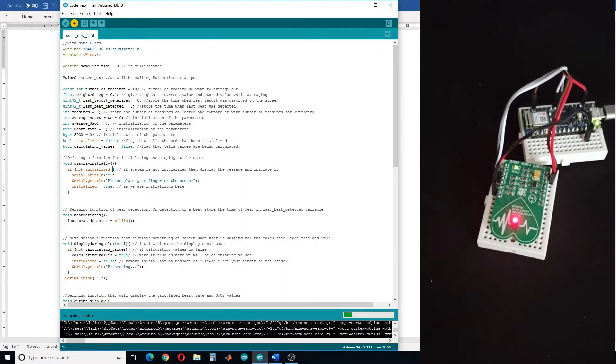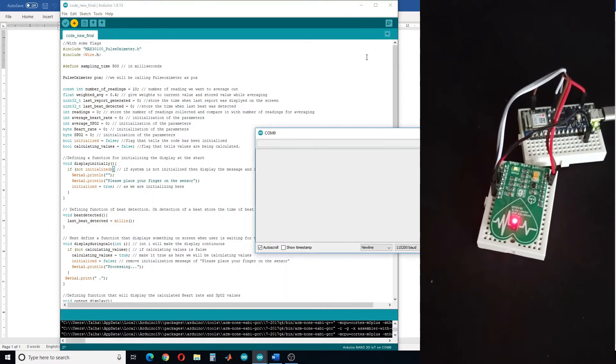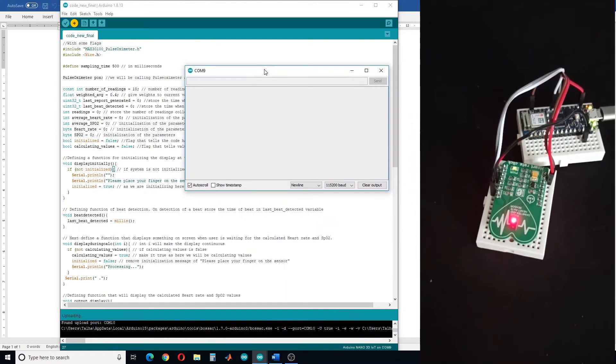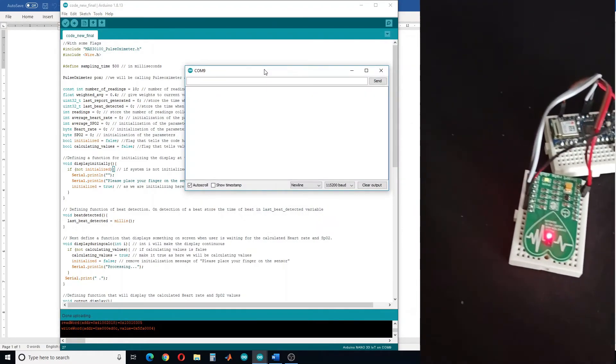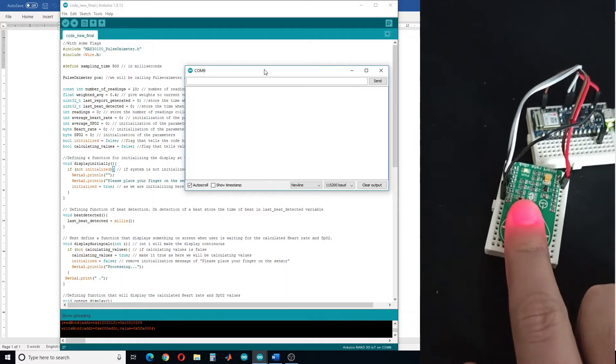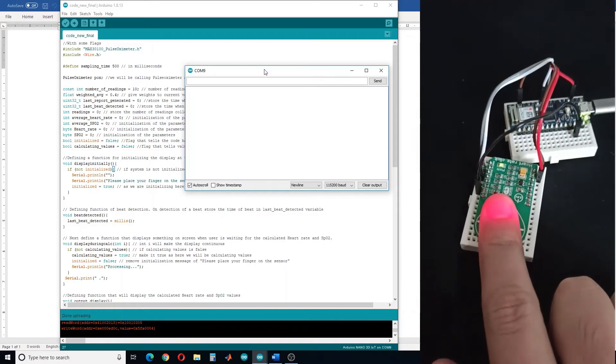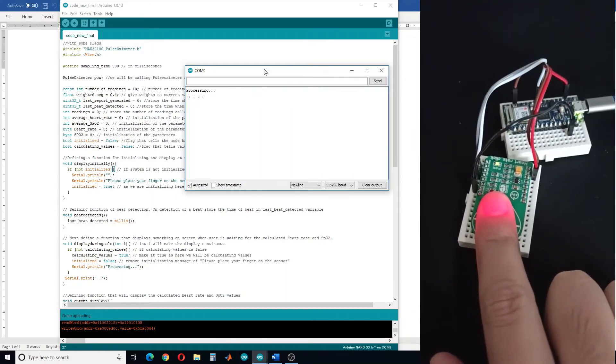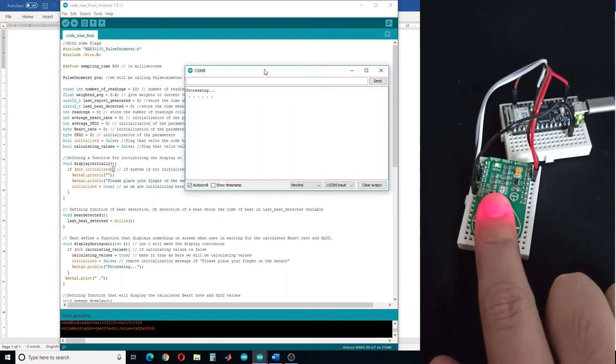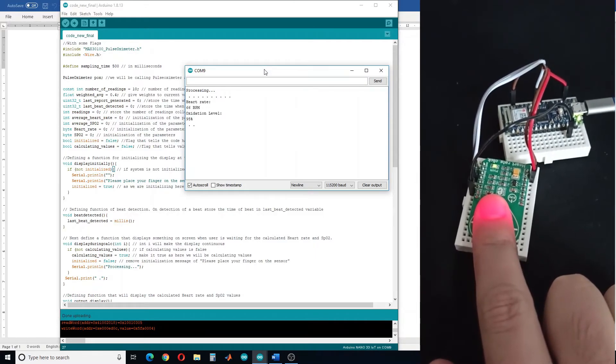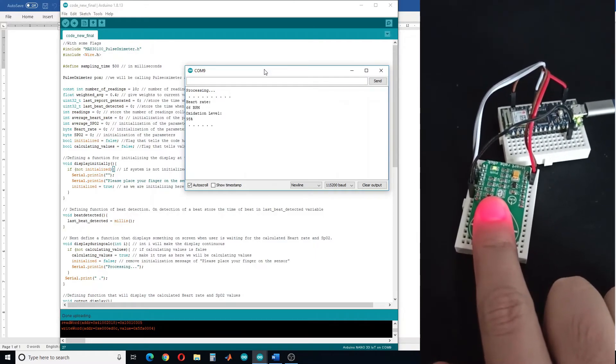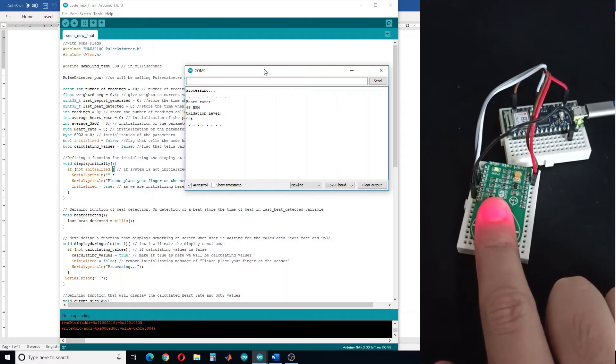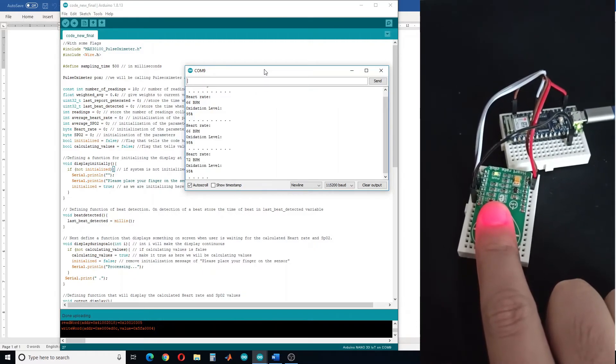Open the serial monitor. After the code is uploaded, place your finger on the sensor. It displays "processing" and after every five seconds it will update the heart rate and pulse oxygen saturation levels.